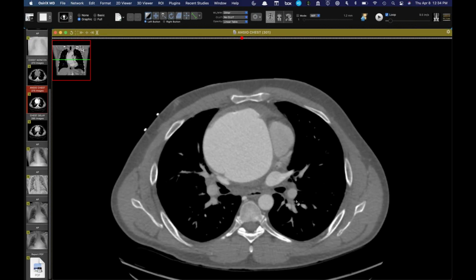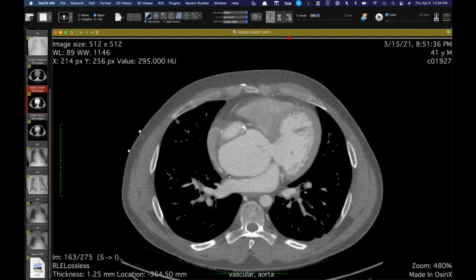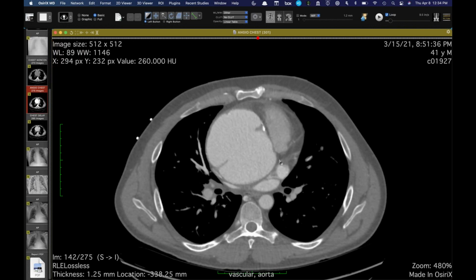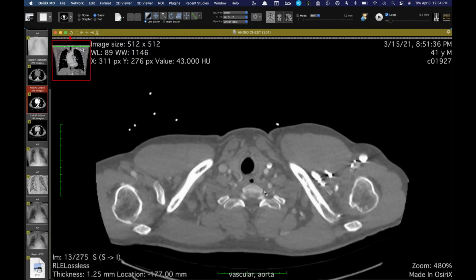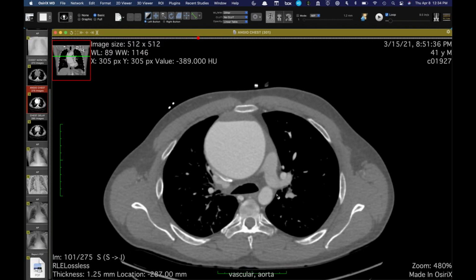How old is this guy? 40, I think he's 42, 41. His brother passed away. Yeah, so it's some sort of elastopathy. I agree. They haven't finalized the workup. How about Loeys-Dietz, if it's not Marfan's? Yeah, right. Or the vascular type of Ehlers-Danlos, maybe. I don't know. We don't really see his vertebral arteries to see how tortuous they are. But yeah, I agree, this is some sort of genetic thing.